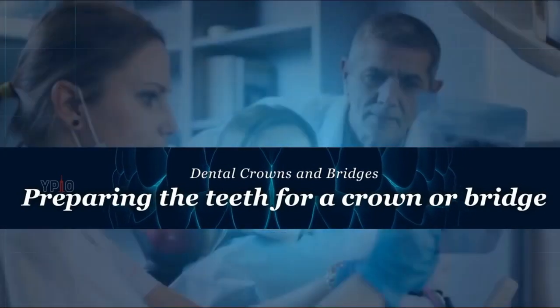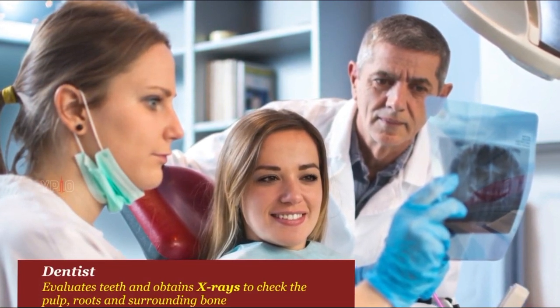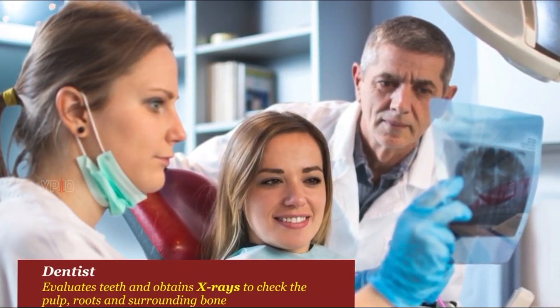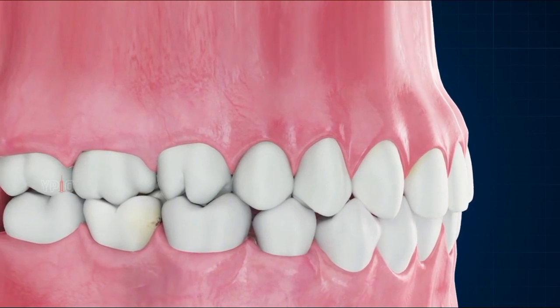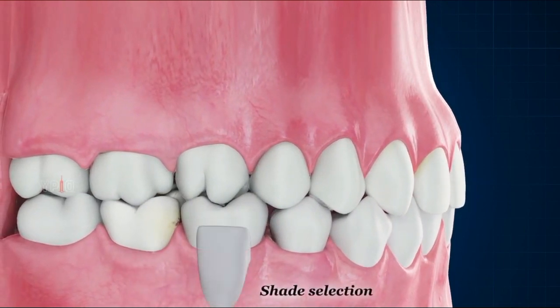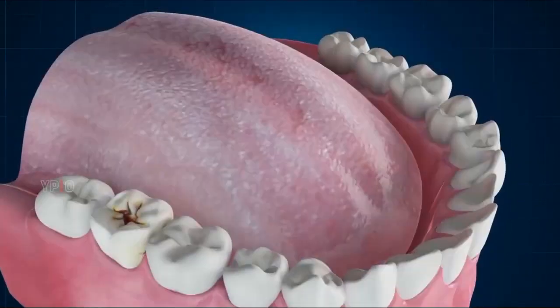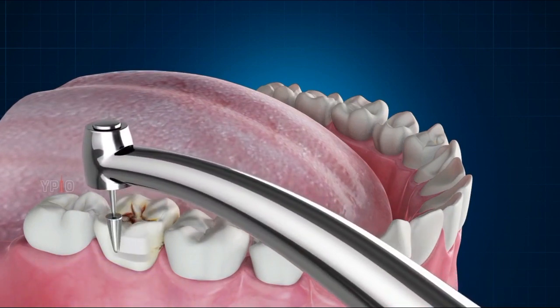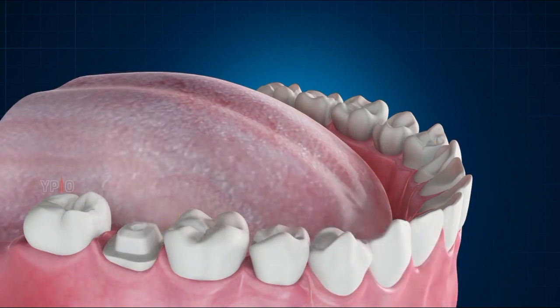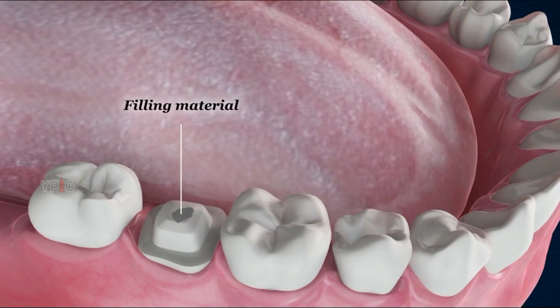Your dentist will first evaluate your teeth and obtain x-rays to check the pulp, roots, and surrounding bone. If a tooth-colored crown or bridge is being made, your dentist will select a shade that exactly matches your teeth. If there is likelihood of infection, a root canal treatment may be recommended before preparing a crown. To begin preparation, the teeth and gums are anesthetized, and a drill is used to grind down the tooth surfaces to make room for a crown. A tooth may have to be built up with filling material if there is excessive damage or decay.